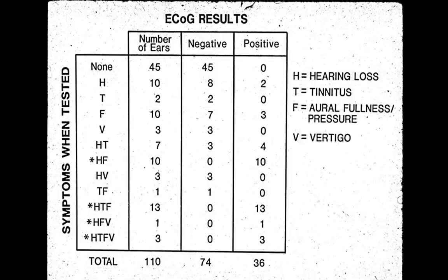Again, they can vary from none at times, and why would you expect to see a change in the electrocochleogram if there are no symptoms present? The ECoG, we found, is kind of a thermometer, not necessarily a barometer of anything. And for practical purposes, the ear is normal at that time, at least at the sensitivity level we can measure with our tests. But as for symptoms, hearing loss itself, not very many. Fullness, really not very many.